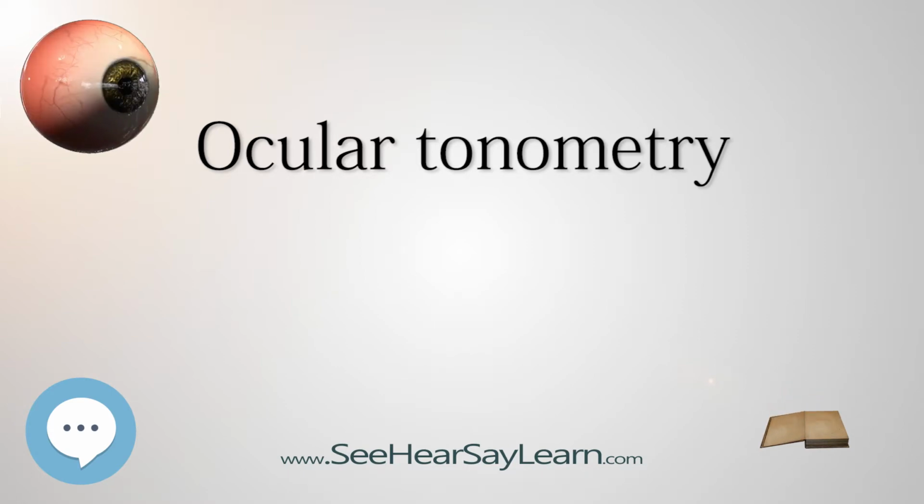Noncontact tonometry. Noncontact tonometry, or air puff tonometry, is different from pneumatonometry and was invented by Bernard Grolman of Reichert, Inc., formerly American Optical. It uses a rapid air pulse to applanate, flatten, the cornea. Corneal applanation is detected via an electro-optical system. Intraocular pressure is estimated by detecting the force of the air jet at the instance of applanation.